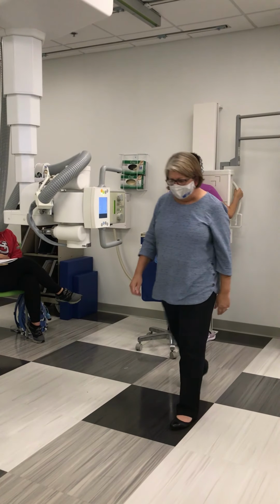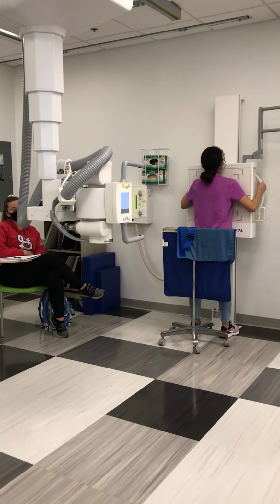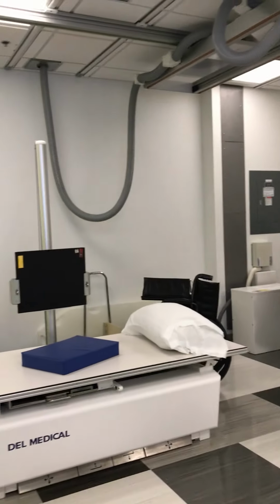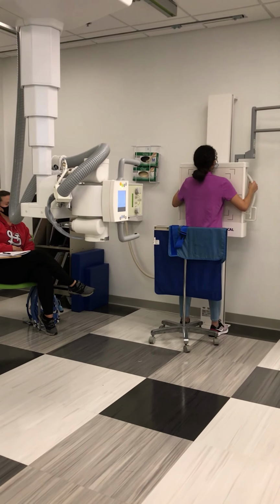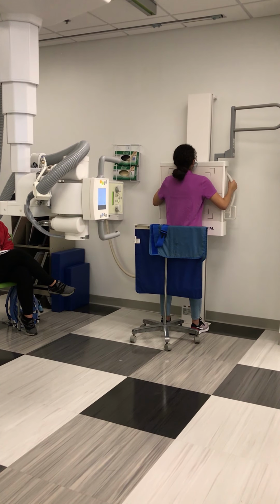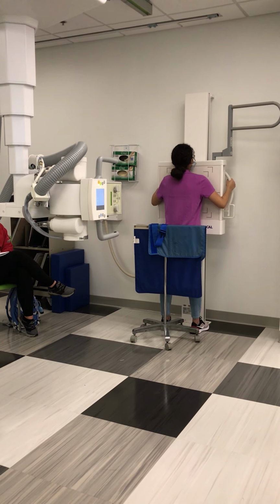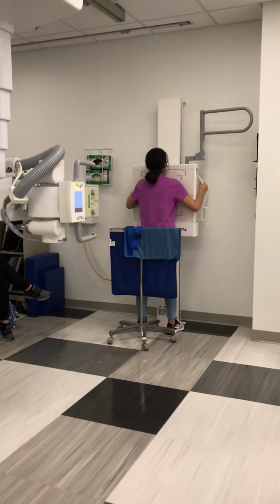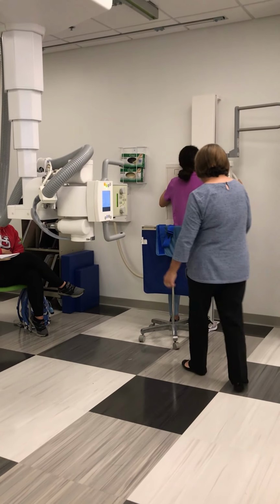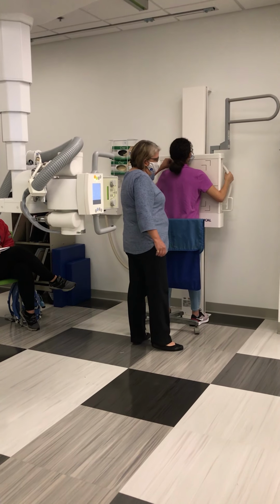I'm going to give you some breathing instructions. So you'll come back here to this opening, and you will say, take a deep breath in, blow it all the way out, take in another deep breath, and hold it, exposure. You may breathe, and relax. So that's my PA chest.